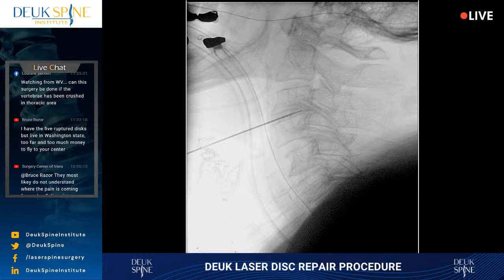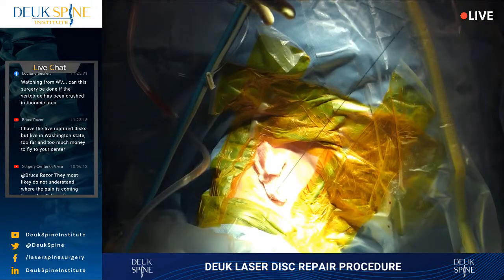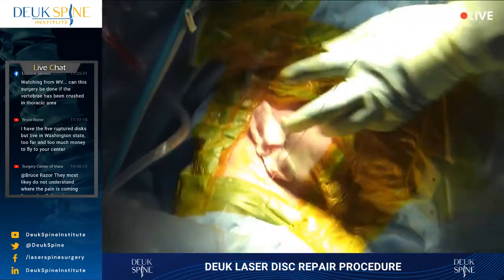Things are a little sticky here, so I don't want to accidentally pull my guide wire out. It must stay in position. If we lose the guide wire, we have to start over. All right, now we've got our guide wire in position.